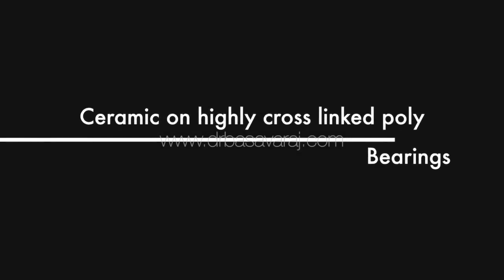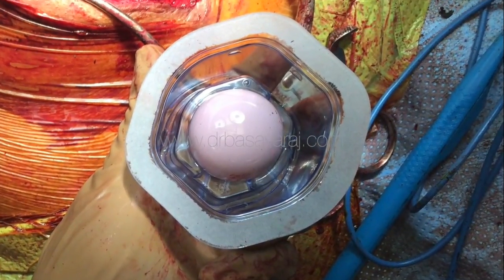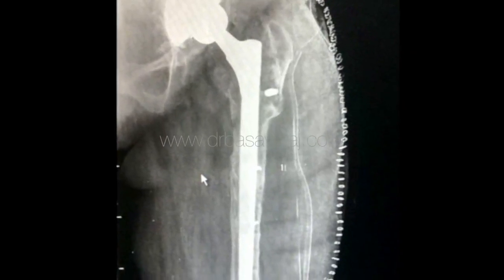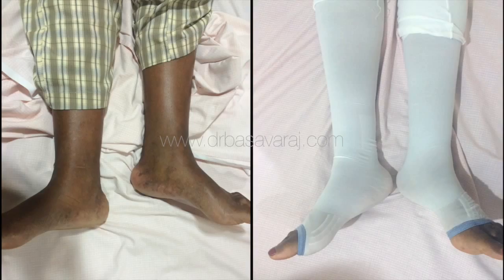Bearing surfaces made of ceramic were used so that the joint lasts longer. These are the x-rays taken immediately after the revision surgery. In the following pictures, we can see that the limb shortening is rectified.